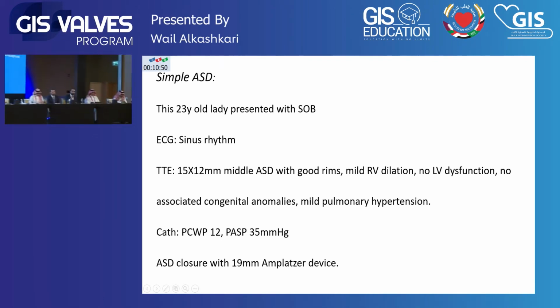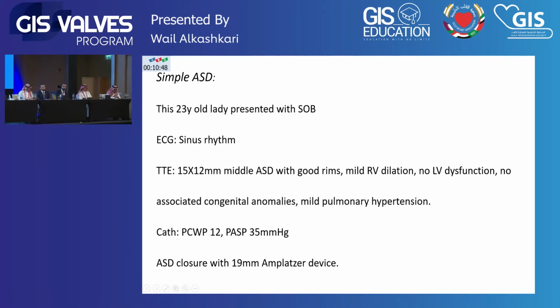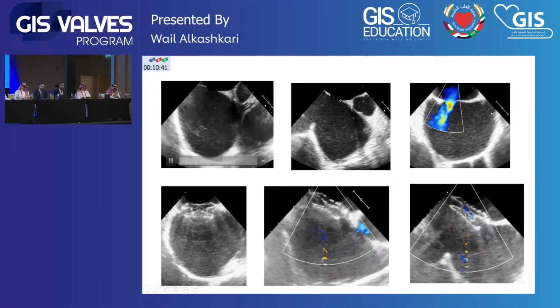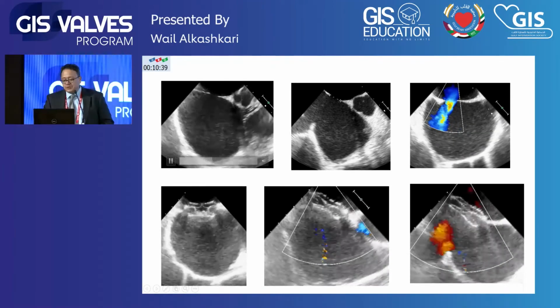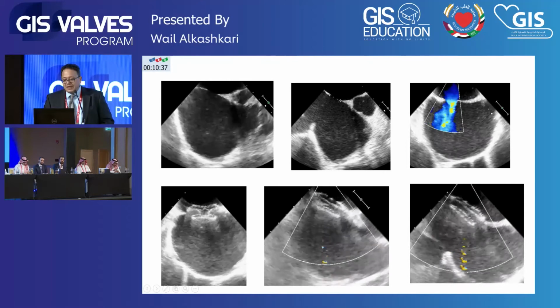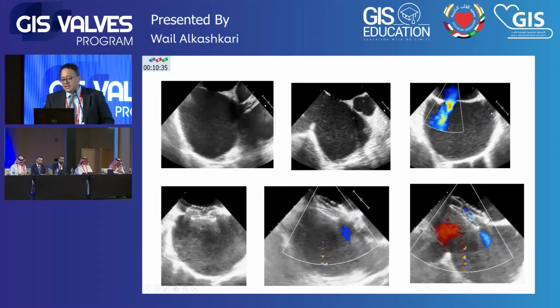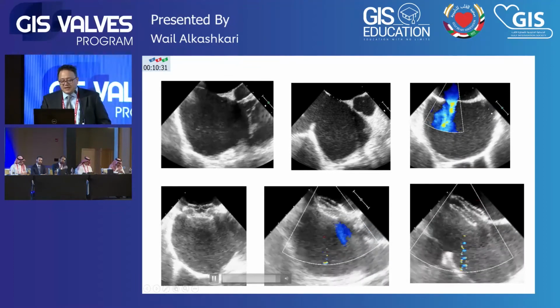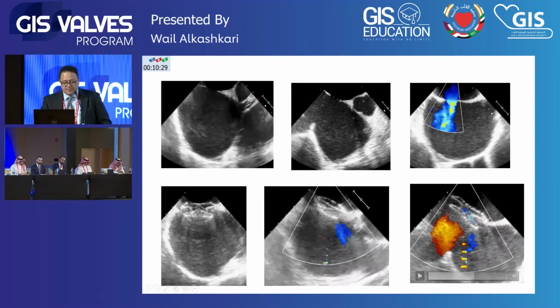RV dilatation, good function, no LV dysfunction, which is fine, ASD closure with 19. So that's how it looked. This is at the 0 degree. You see this is the AV rim, this is the posterior rim, and at the aortic level this is the aortic rim, this is the inferoposterior, this is bicaval, and this is the device sandwiching all the septum.